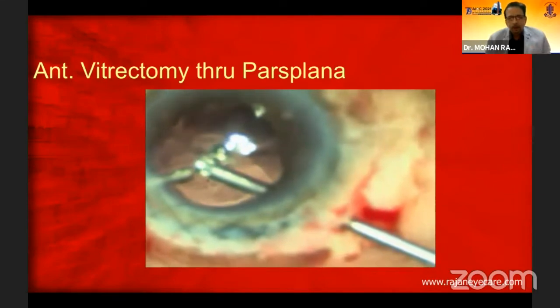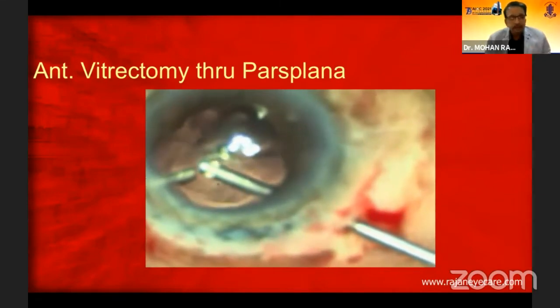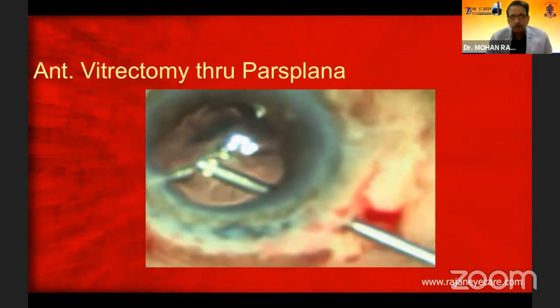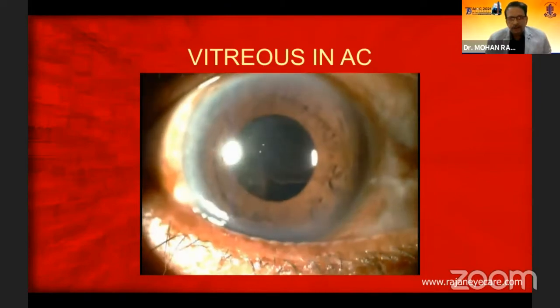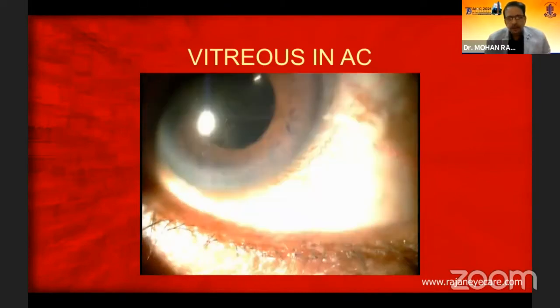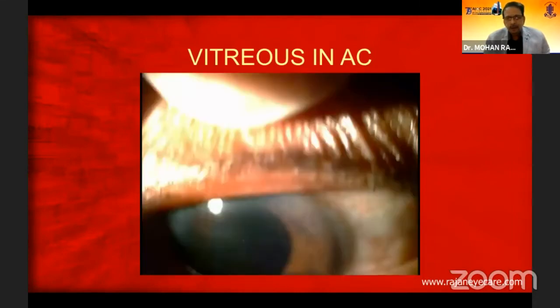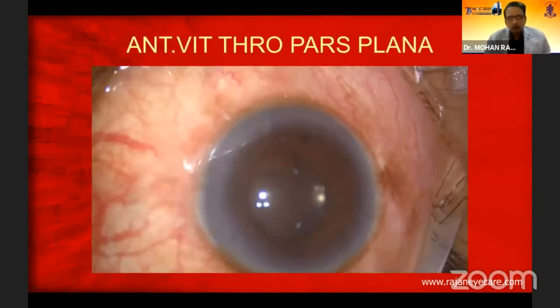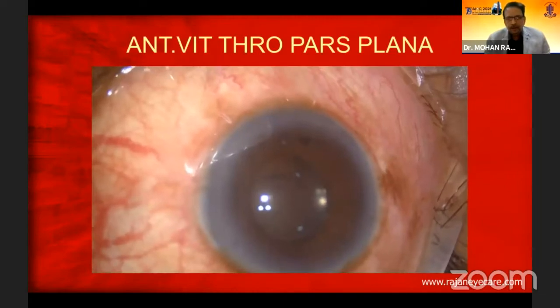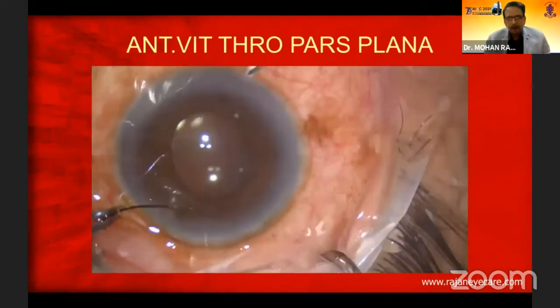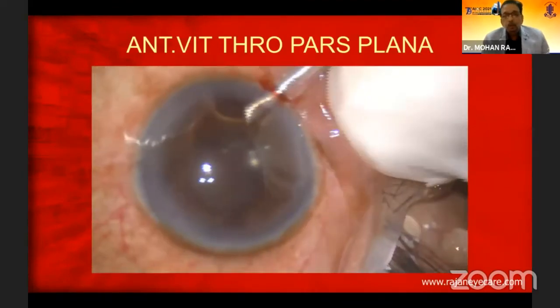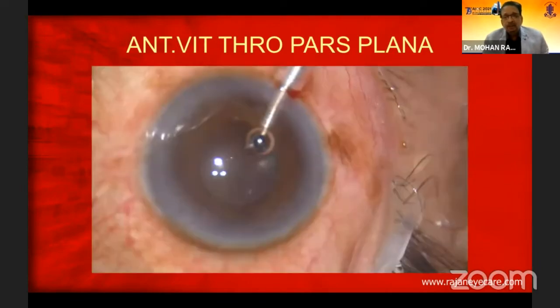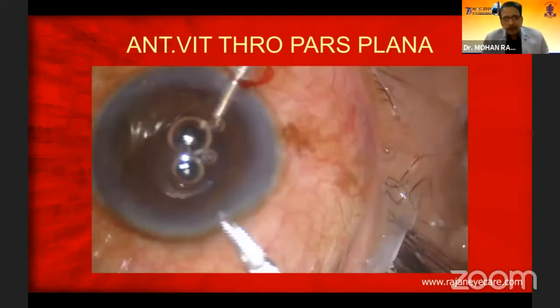Nowadays the pars plana route, as advocated by Abhay Vasavada, is supposed to be very easy. You can see this particular patient had vitreous in the anterior chamber — there's a blob of vitreous with eye pressure pushing as well. I'm trying to go in and remove the vitreous by having an anterior chamber maintainer. But more importantly, I want to remove the vitreous more effectively from behind, so always create a pars plana entry.